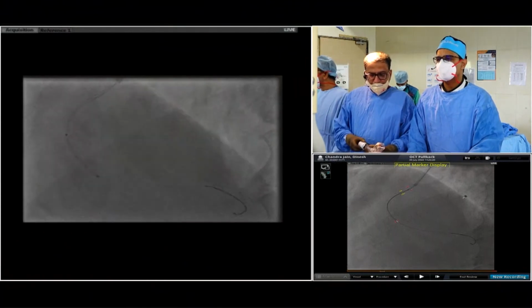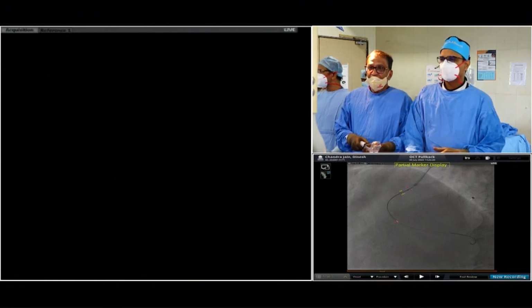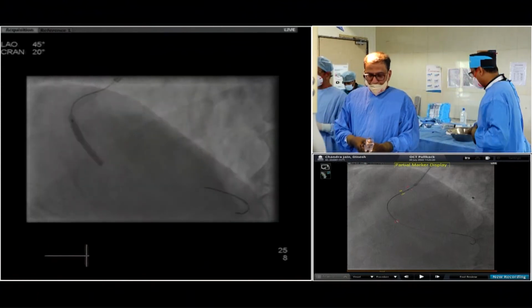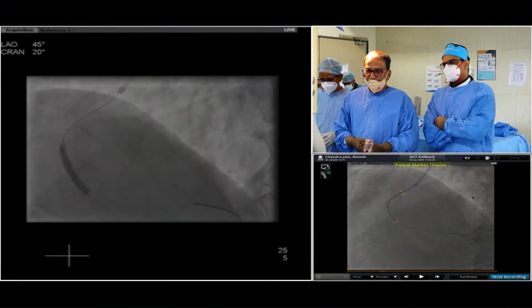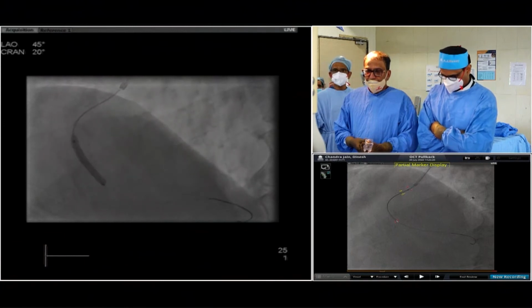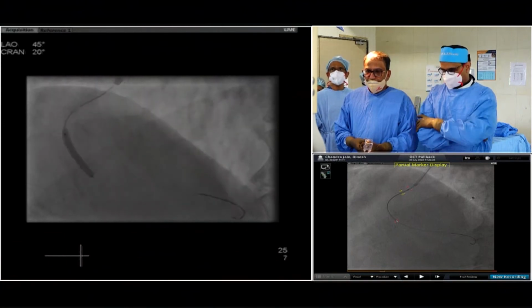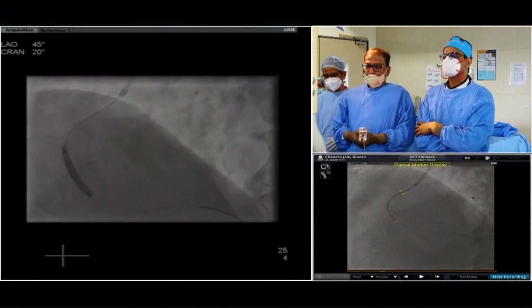Yeah, we'll just go to 10. 10 nominal, no? Yeah. We'll stay at 20 seconds for this. Can you explain how exact the placement will be using this method? Maybe your mismatch will be 1 or 2 millimeters or less?